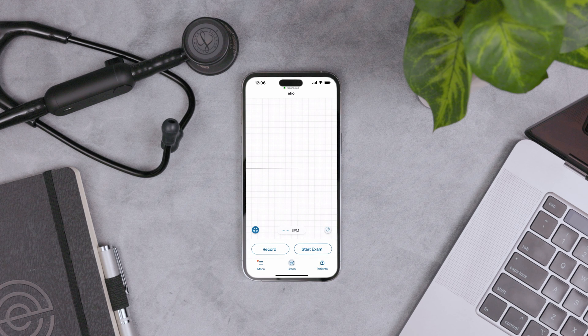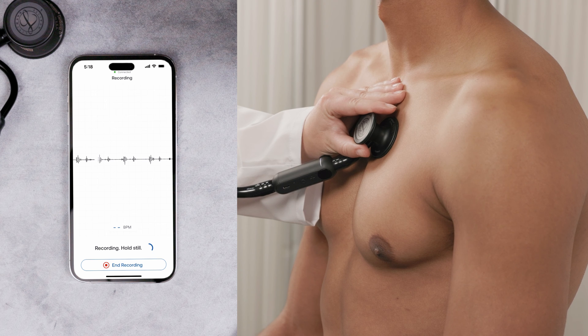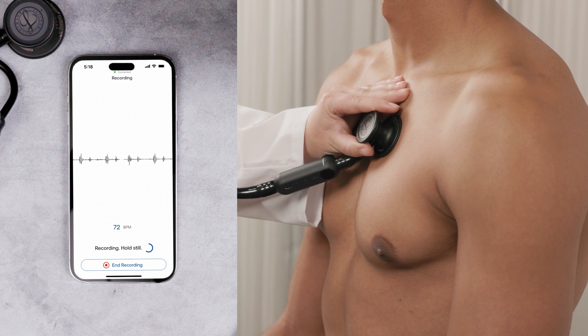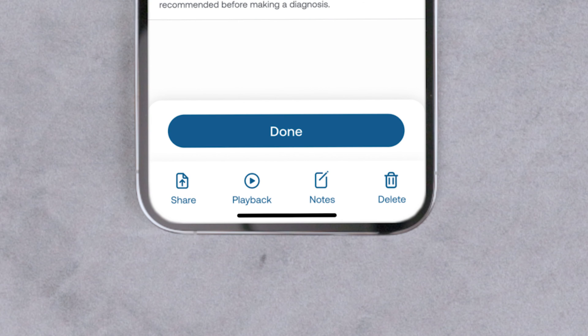Now let's take a recording. Place the device on the patient — recording begins automatically if the Record Automatically setting is on. Keep the device still for best analysis and audio quality. You can see the recording and analysis results on the Summary screen. Here you can also export or print the recording by tapping the Share button.